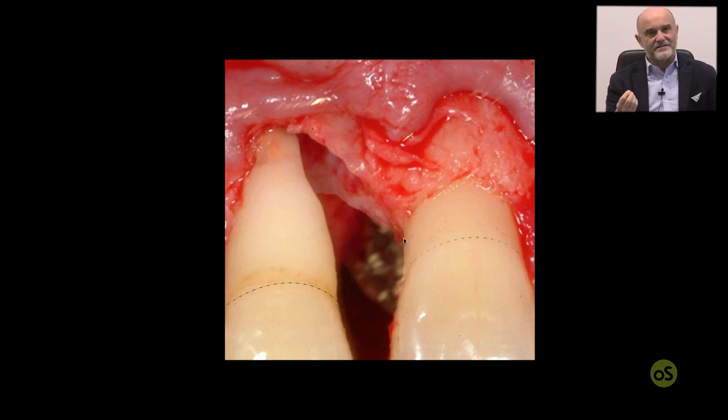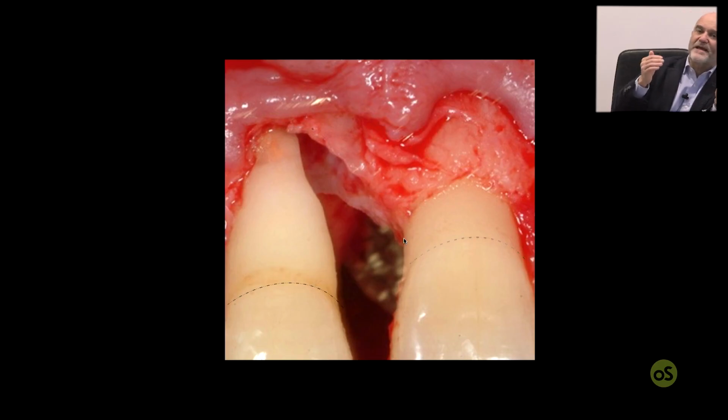Healthy dentin is the dentin that is hard, smooth, clean, with the dentin tubuli exposed to the oral cavity. So you don't only have to perform root planing intrasurgically, but you also have to apply EDTA gel 24% for 2 minutes in order to get rid of all the smear layer accumulating inside the dentin tubuli. Now, everything is ready to be closed.